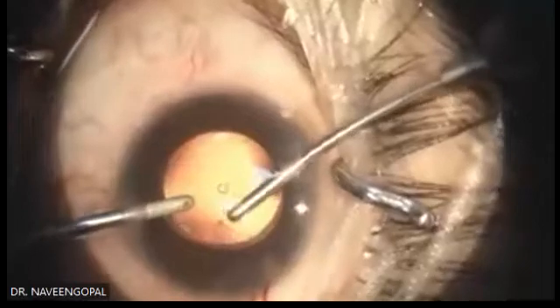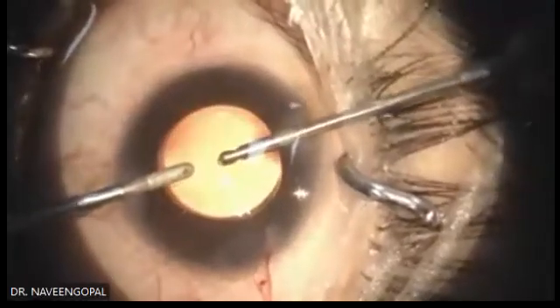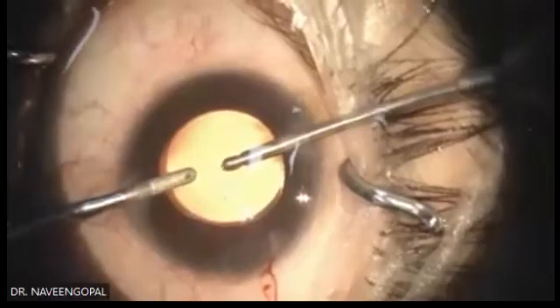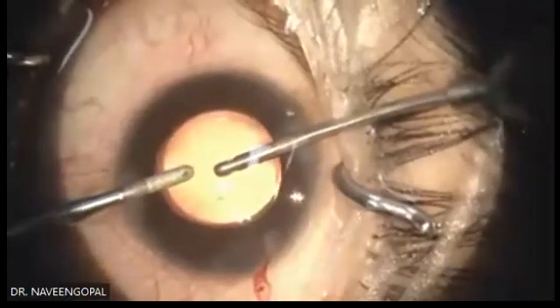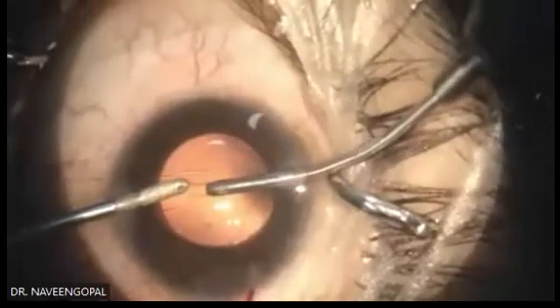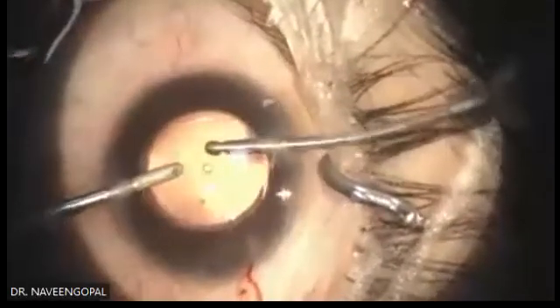Remove it thoroughly. You can do it in 2 ways. Either you can use bimanual IA, or you can use coaxial IA, or some people use Simcoe also. I'm comfortable with this since I am very used to the bimanual IA. I remove it thoroughly until I see all the strands of visco removed.